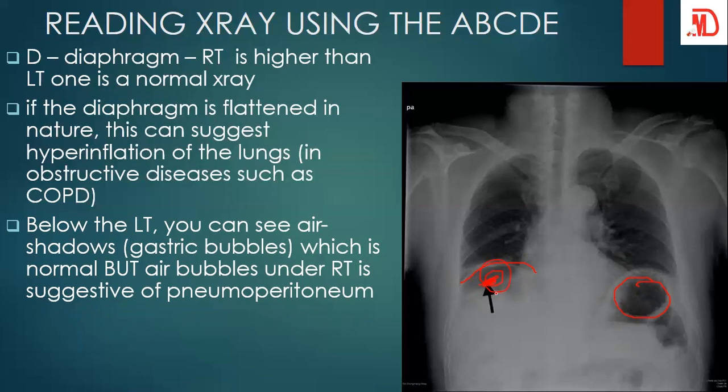Again, look at it. Beautifully. Oh, what am I doing? Anyway, guys, don't mind me. So you see your clavicle. Can you see some ribs? That's just by the way.